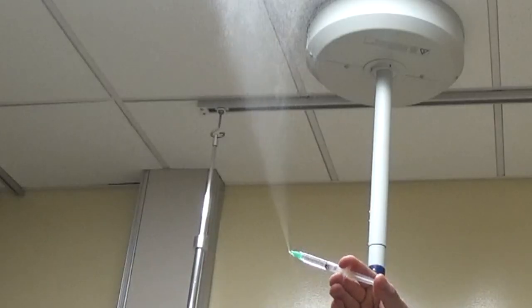Preview. Today I'm going to show you how to make an atomizer out of basic ED equipment.